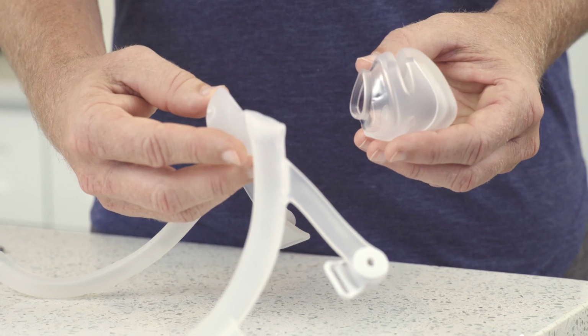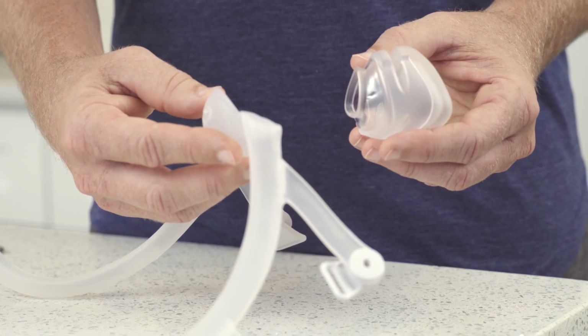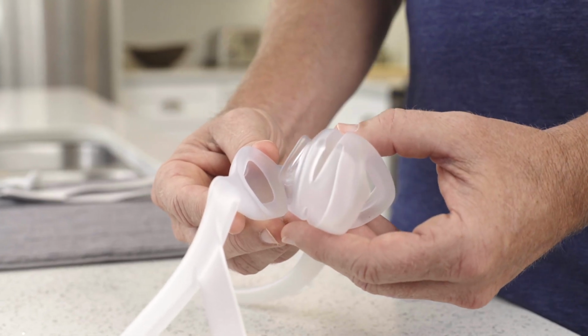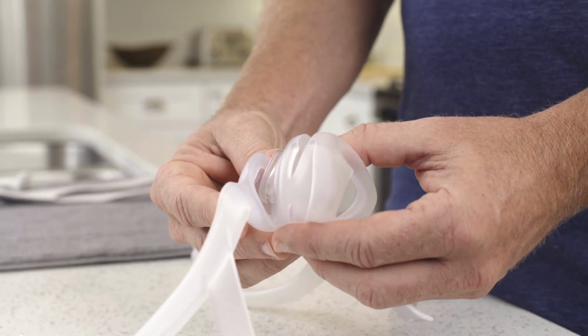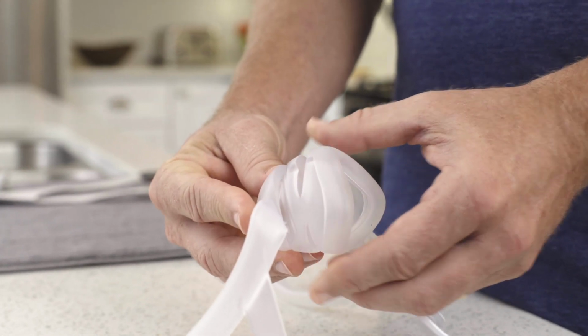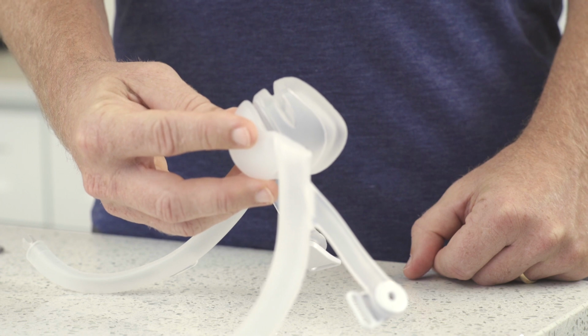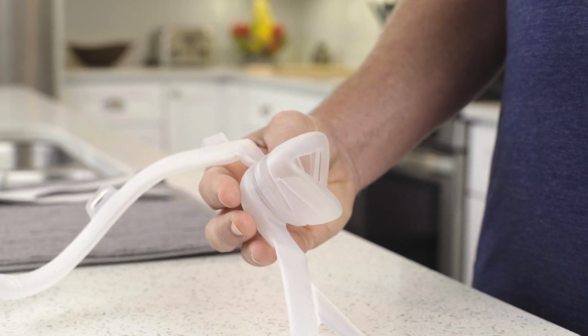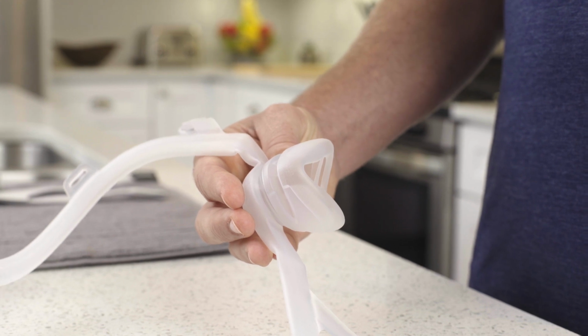To reassemble the DreamWisp mask, first align the cushion and frame. Notice that the openings have a similar shape. Attach the cushion to the mask frame by resting one edge of the frame against the cushion and rolling it into the opening. Make sure the raised edge of the mask cushion is fully inserted into the mask frame.